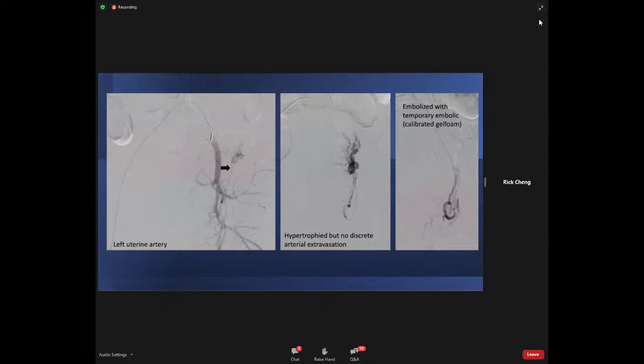One note to keep in mind in terms of performing uterine artery embolization is that oftentimes gelfoam is used as the most common agent. It provides temporary cessation of flow, usually recanalizes within 3 to 6 weeks time. Sometimes particle embolics can also be considered. However, one should avoid using very small particles to avoid uterine ischemia.